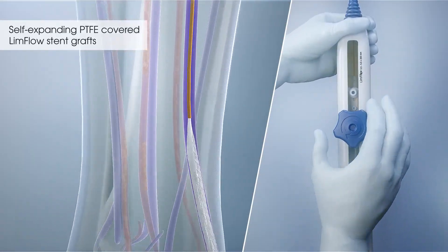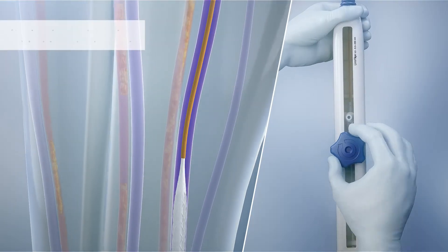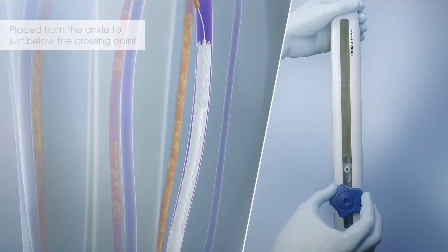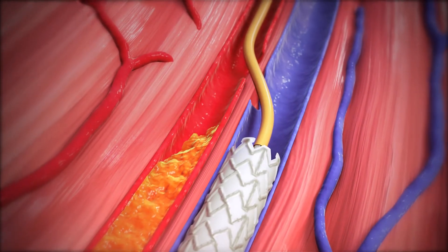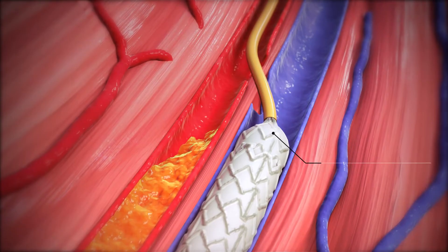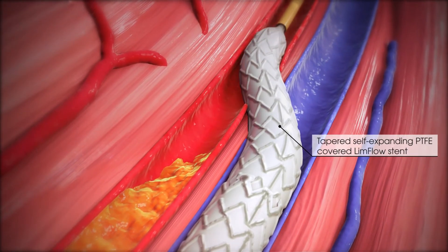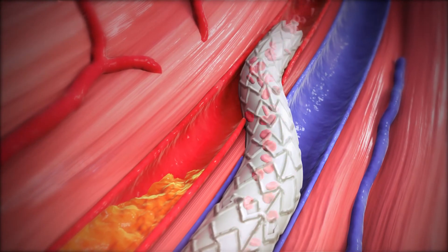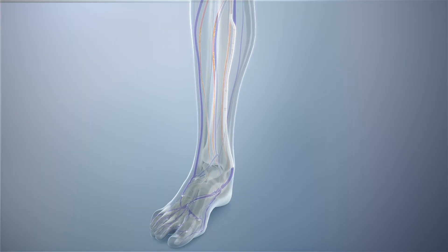Self-expanding PTFE-covered LimFlow stent grafts are placed from the ankle to just below the crossing point, creating a permanent conduit for continuous arterialized blood flow. Finally, a tapered self-expanding PTFE-covered LimFlow stent is deployed to optimize the transition and flow from the artery into the vein, completing the arterialized circuit.